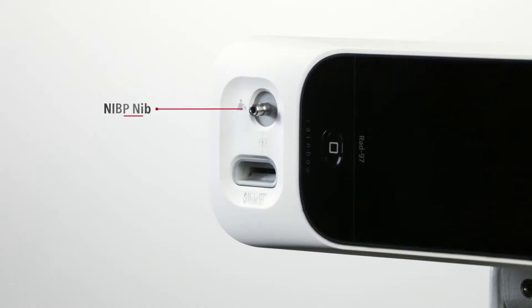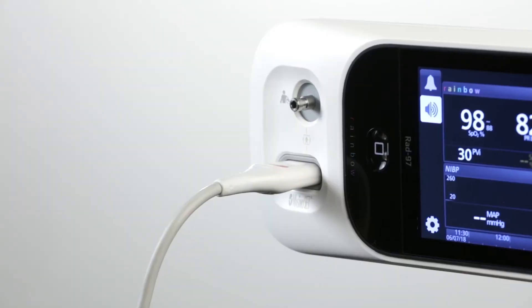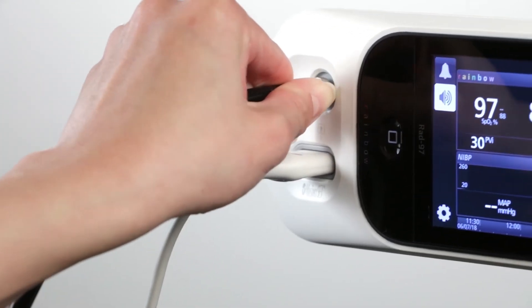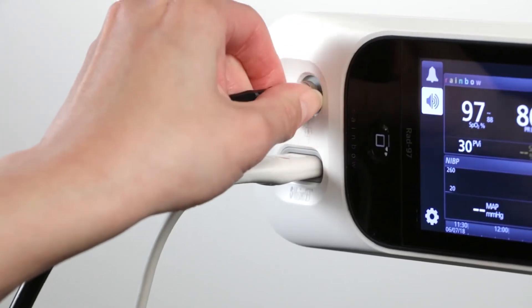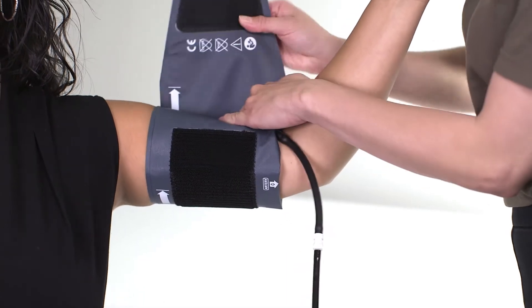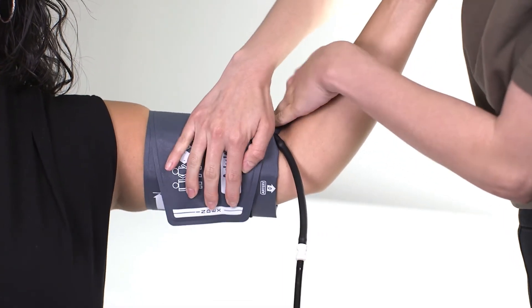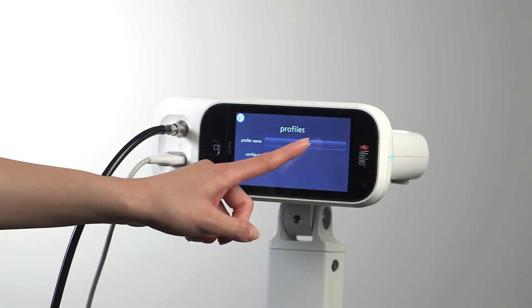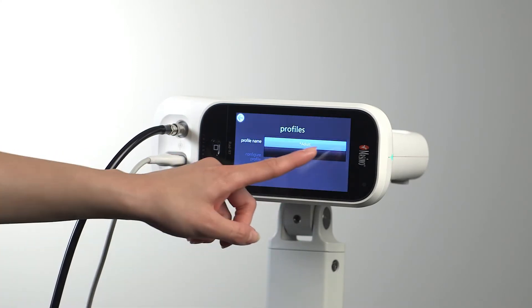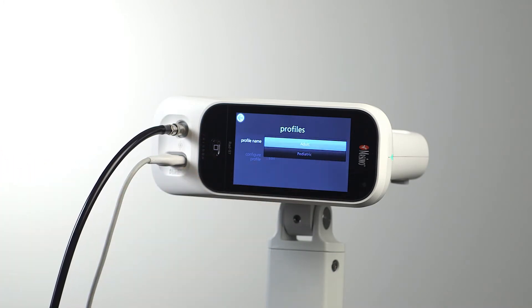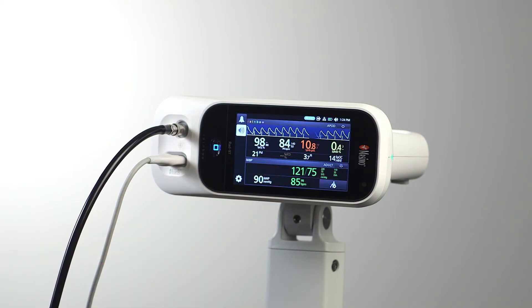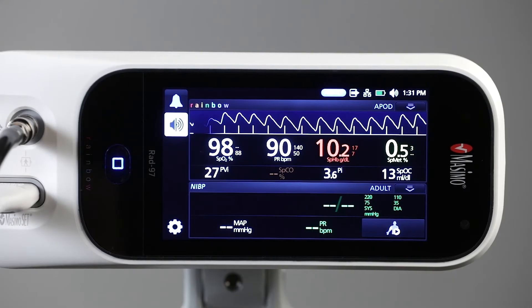Using the built-in NIBP nib on the front of the device to take a blood pressure measurement, connect an adult and pediatric or neonatal blood pressure hose to the RAD 97, connect the cuff, and ensure the cuff is placed properly on the patient. Also ensure the correct patient profile is selected before taking a measurement.